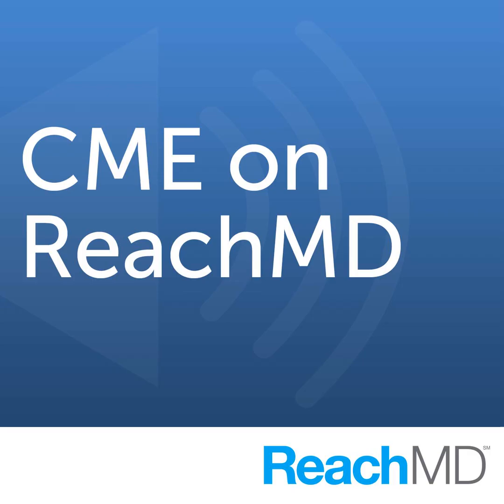Again, nicely shown in our guidelines, and with a focus on HCM, it's important because that will highly influence our therapy if there is another underlying cause like amyloid or Fabry disease. You are aware of it, and the CMR can help to guide you. But by the way, if you don't get a reliable result, don't forget about the possibility of the biopsy. And of course, at first, multimodality imaging. So, just know the recommendation is that contrast-enhanced CMR is recommended in patients with cardiomyopathy at initial evaluation, and that is also, of course, true for HCM because that will help you with the guidance.